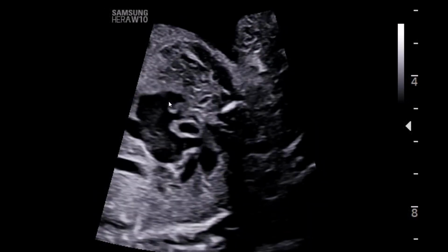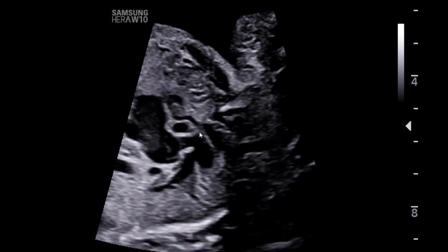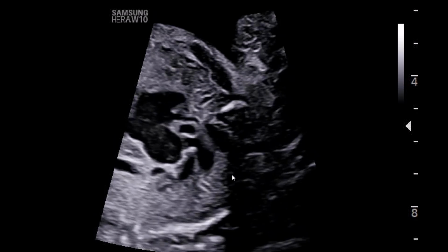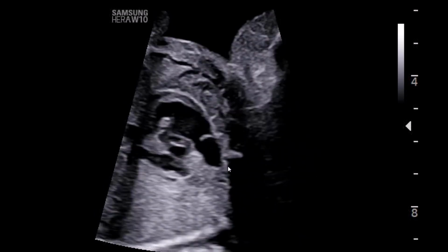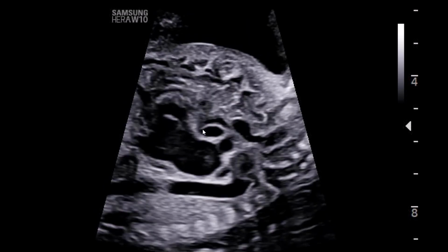And so we'll try to do several of these sweeps just to confirm or disprove the fact that there is interrupted aortic arch. Here, a really nice look at that ductal arch here at the end. Nice hockey stick looking appearance. And then again, ascending aorta. And this is the point at which there is not a connection between the aorta and the ductal arch. There is no aortic arch here. So still trying to see.